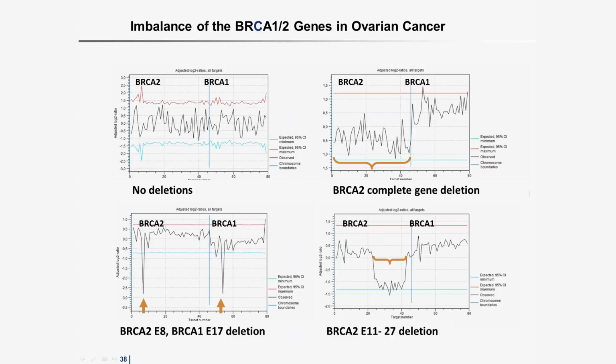The problem was that we sometimes had an imbalanced amplification due to DNA quality differences. And this imbalanced amplification we had in both methods.